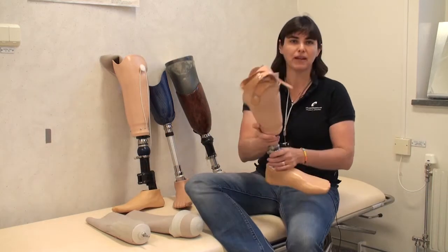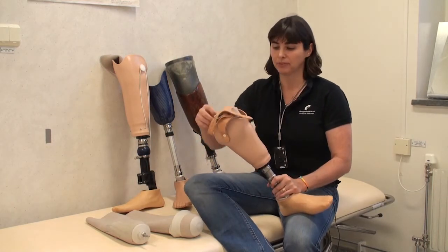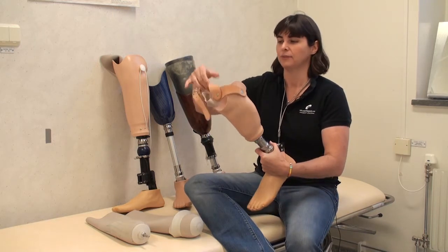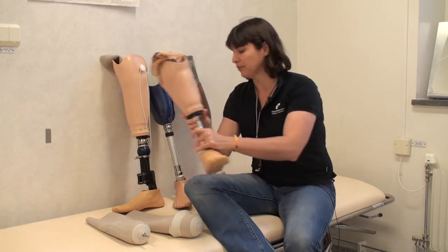So how do we keep a prosthesis from falling off when our patients are walking? Well, there's a number of different methods we use, and I have some examples here. The first example is a very simple cuff, which is a leather strap that passes around the leg.